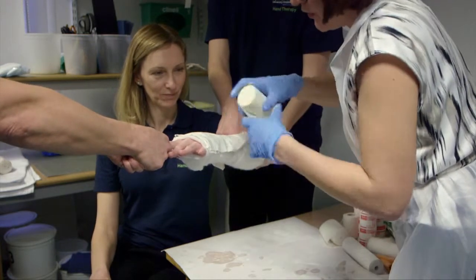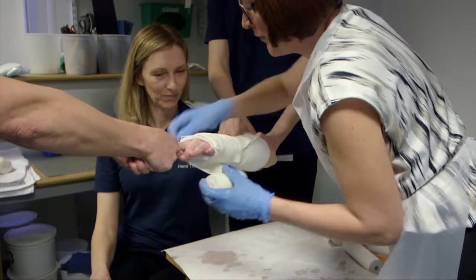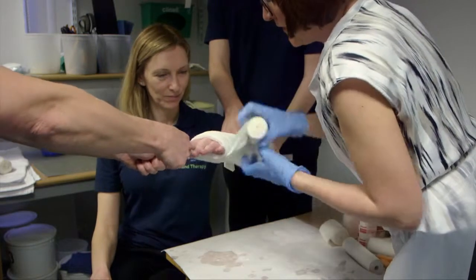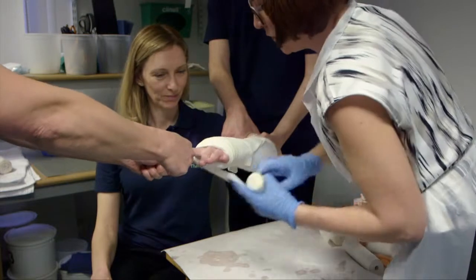When applying the bandage and also the wool, always come out through the thumb so that you don't tighten the first web space. You should only ever have two passes in the first web space and minimal padding on the dorsal radius where you want to apply pressure.